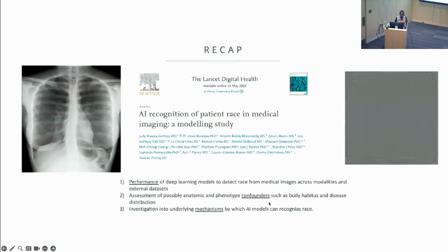I told you the inspiration for this was the Singapore Datathon from Moning, who's sitting there, which ended up with our paper showing that AI can predict the race of patients from chest x-rays, right? Just because a label doesn't exist, it can still be included, and I'll show you some of the new things that we know can be predicted from chest x-rays, and that these findings persist even when the images are very altered. We couldn't figure out why. We still haven't. It's around 2 years later.